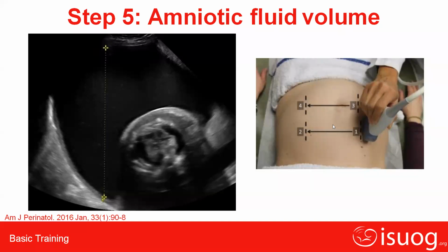Gitanjali, I think one should do blood flow studies here, Doppler in detail. Yes. And if you don't find any other cause, you hydrate the patient, give rest on flanks, deep breathing, and you can give human albumin infusion. That is one substance which will increase the amniotic fluid when no other cause is found. So everybody should know that human albumin infusion in oligoamnios, severe oligoamnios, does help. At least in my practice and in the medical college when we were working.